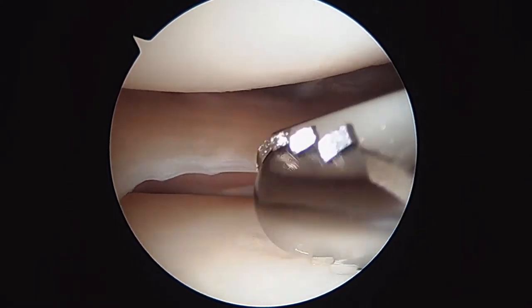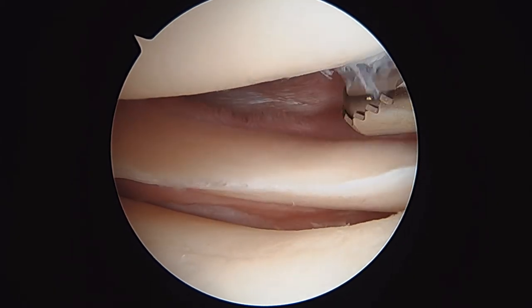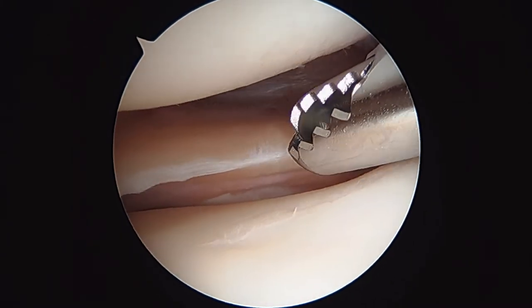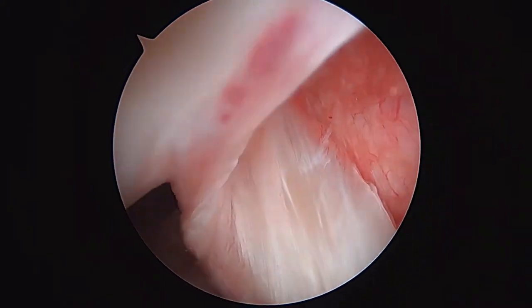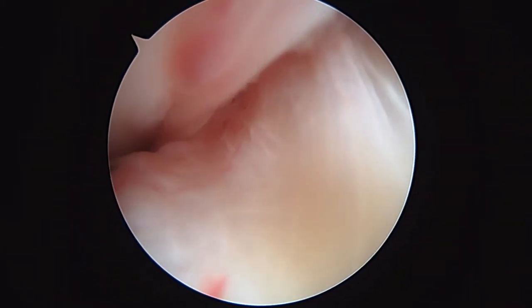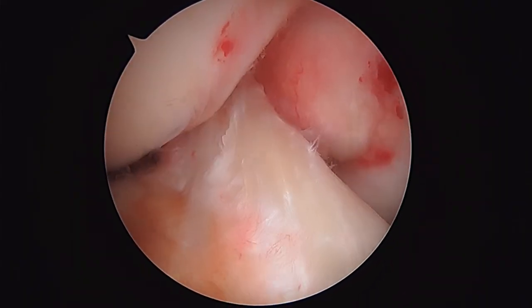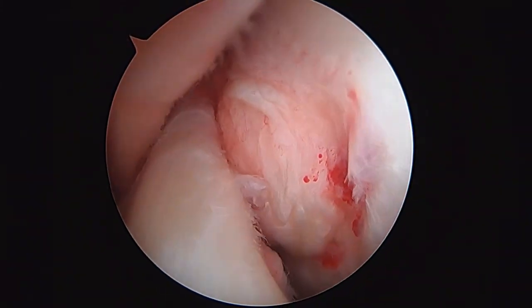Comfortable that we've seen everything we need to see. We're going to finish up here and get you back to the recovery room shortly. Now we are going to inject the bone marrow concentrate as an intra-articular injection. I just want to show you the ACL again. So there's the ACL, and that looks good.